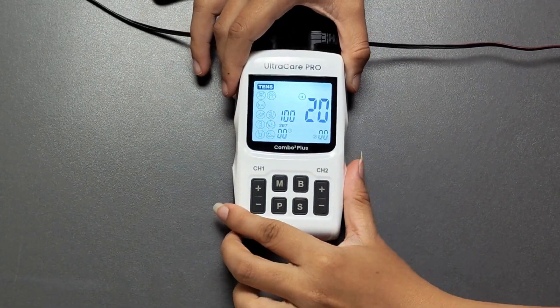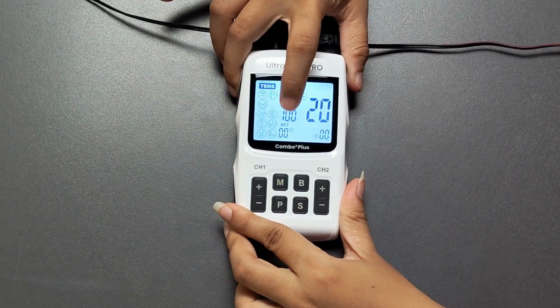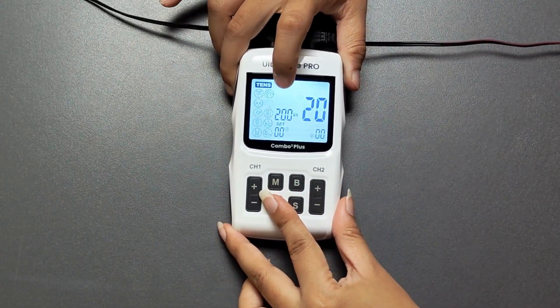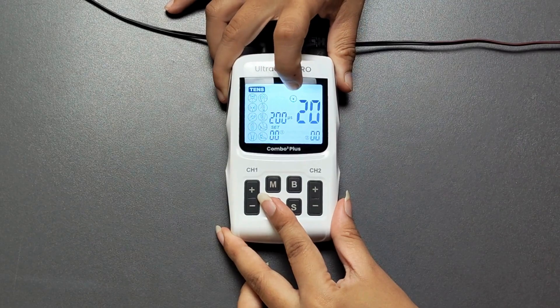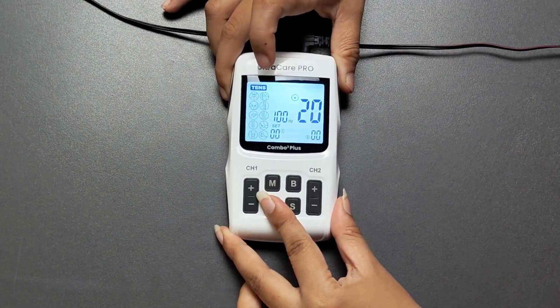Once U1 mode is selected, press S to enter the settings menu. Within the menu, press P to switch between parameters such as frequency, pulse rate, pulse width, and treatment time.